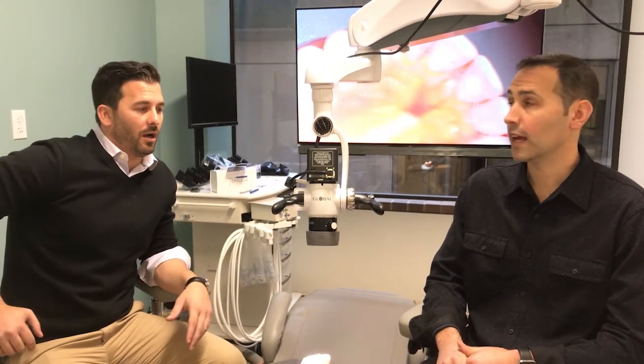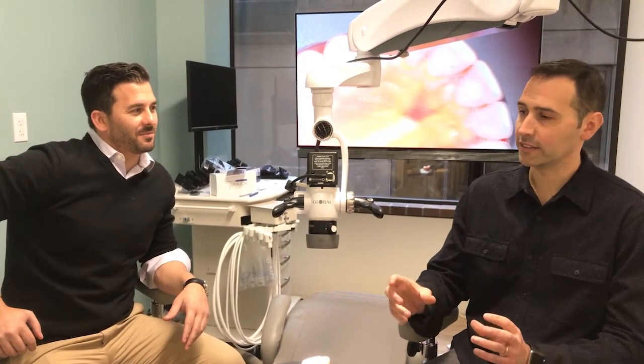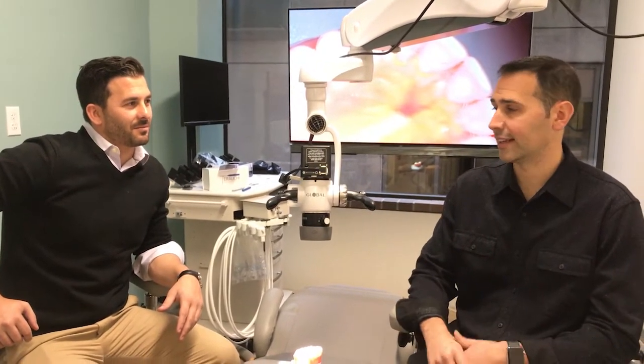We were just talking about doing upper back molars. You can do a direct view without a mirror, which is something that's never been done before. With a microscope you'd try to crank the oculars and see something with direct vision, but it never really works.